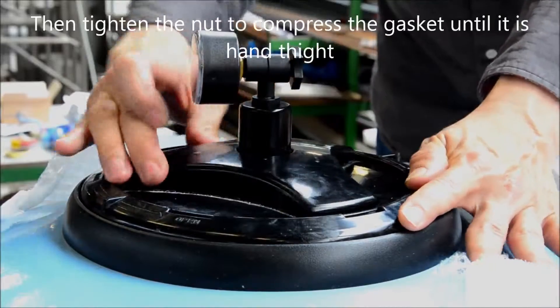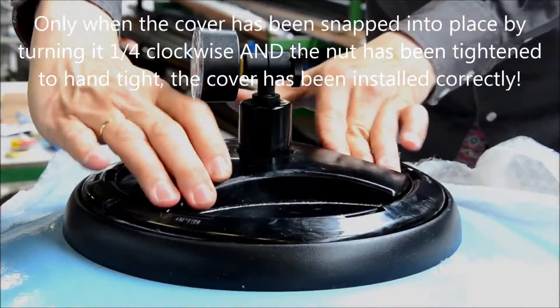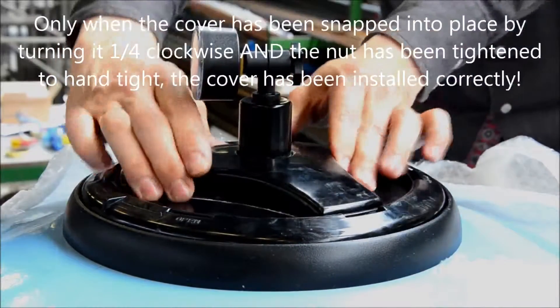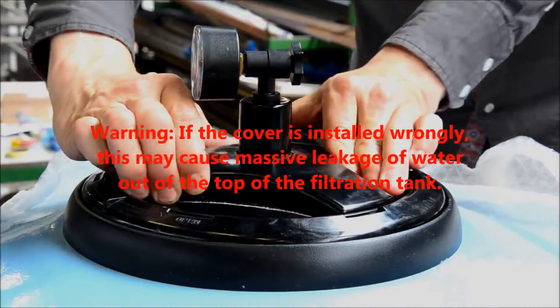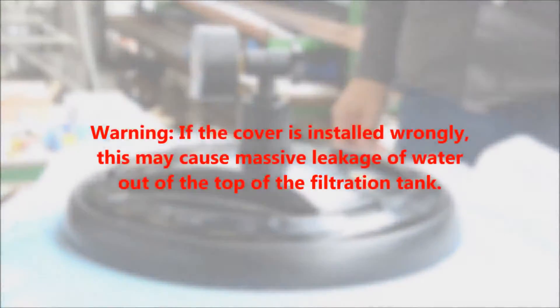Please note: only when the cover has been snapped into place by turning it one-fourth clockwise and the nut has been tightened to hand tight has the cover been installed correctly. If the cover is installed wrongly, this may cause massive leakage of water out of the top of the filtration tank.